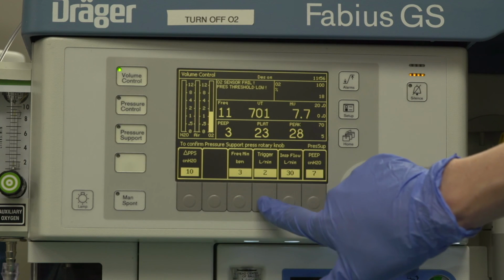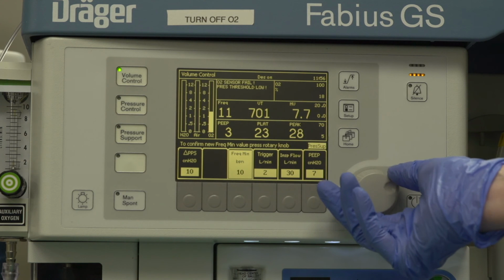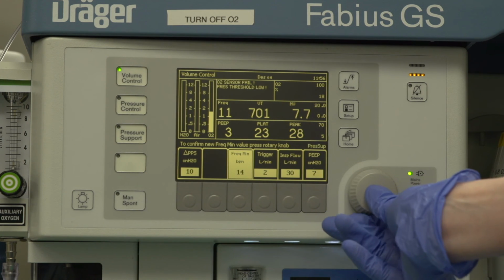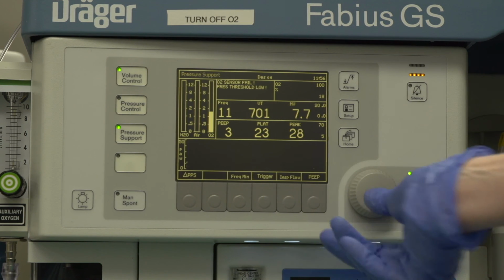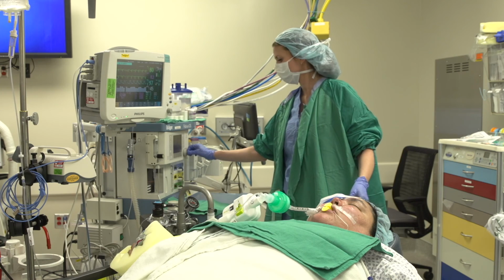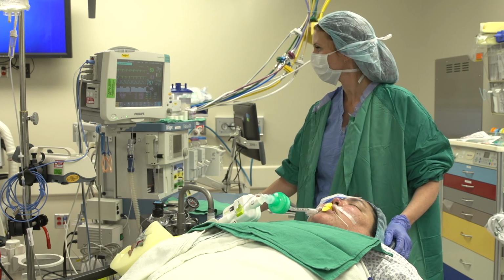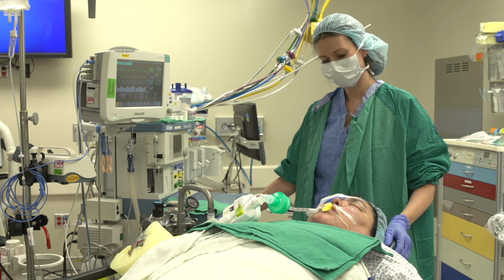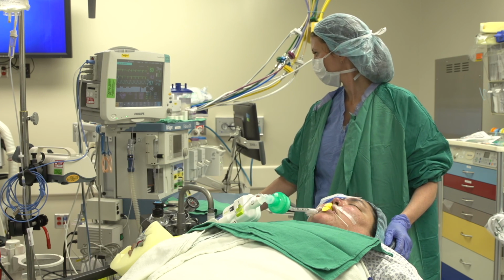In order to obtain maximum benefit from ANEclear in a spontaneously breathing patient, it may be desirable to augment their tidal volume by bagging or using pressure support mode ventilation if available. These methods will increase and optimize minute ventilation. Patients in which minute ventilation is disrupted by excessive coughing could also benefit from synchronous intermittent mandatory ventilation to augment baseline ventilation while supporting spontaneous attempts.